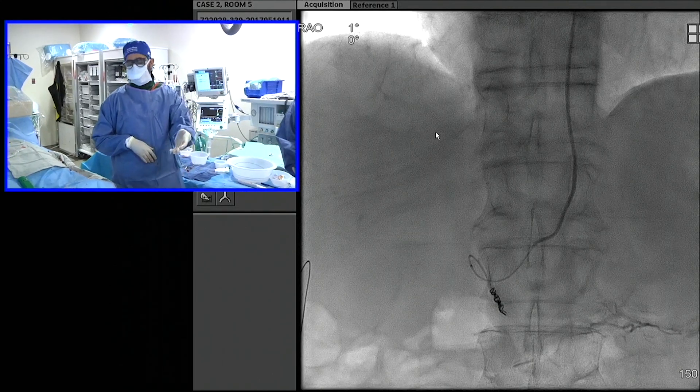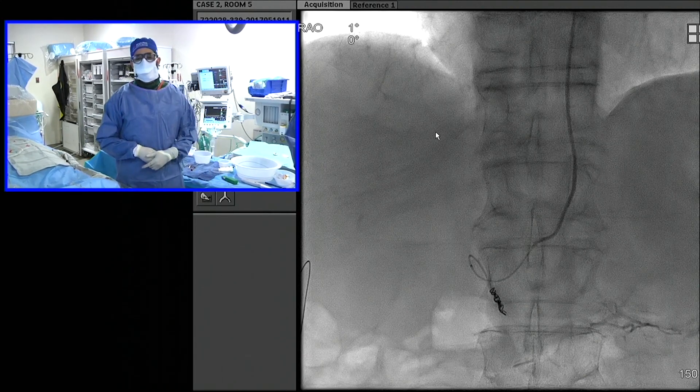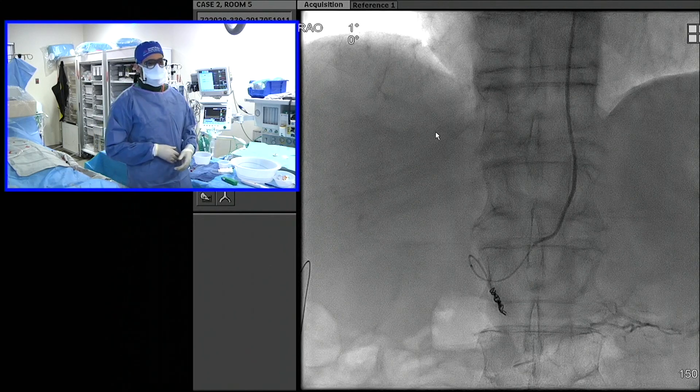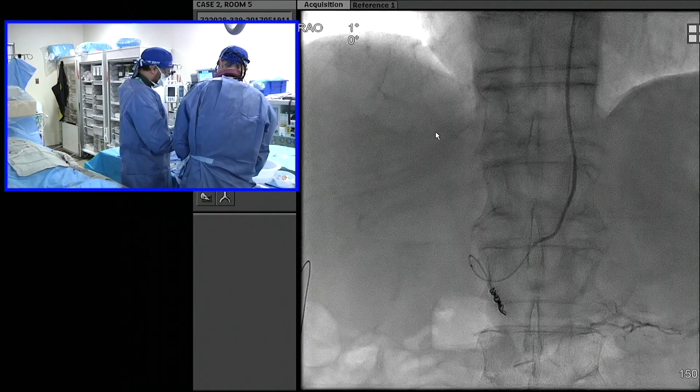We're going to try something here just because we happen to have it — these unshaped POD packing coils. They're basically just long, unshaped coils; really soft. We're going to see if we can just pack that in here. It's the J coil — exactly. It's sort of the same idea, basically creating a backstop and then packing it behind.